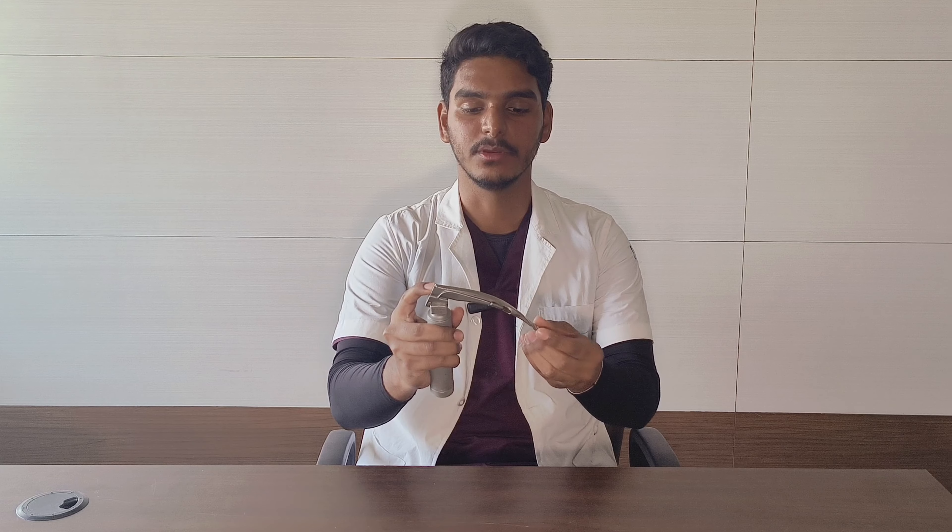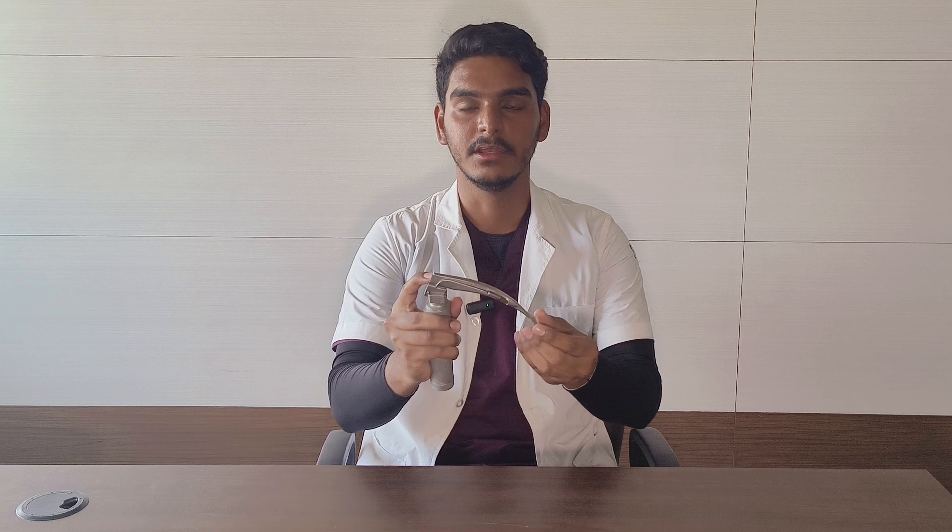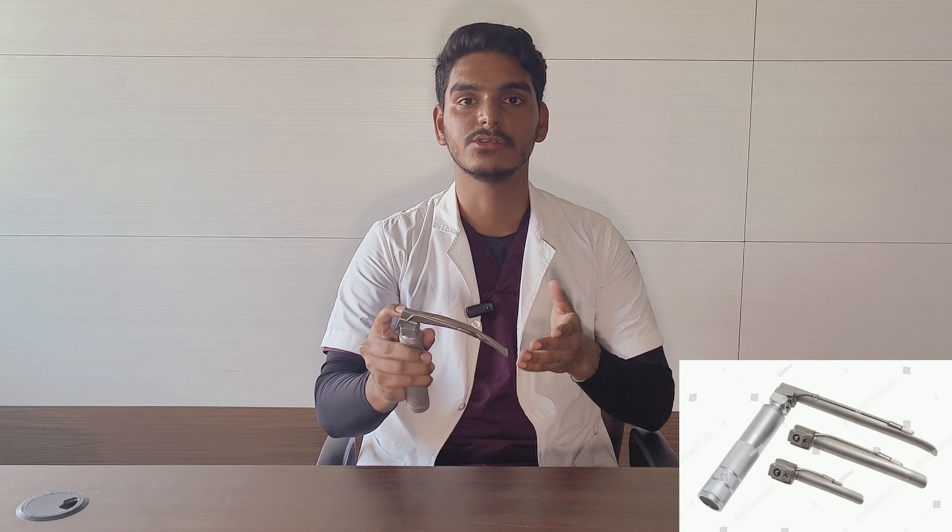Right here in front of me is the laryngoscope. This is a Macintosh type of laryngoscope because the blade, as you can see, is the Macintosh blade — it is the curved blade. And there is a second category of laryngoscope where the blade is straight.